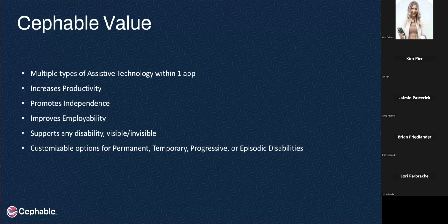We're looking to help everybody not just promote independence, but maximize the independence that they're capable of based on capabilities and strengths and not deficits. On a personal note, as a therapist justifying my services from a deficit lens for IEPs and insurance companies, it's been really exciting to talk with users and work with users and say, what can you do? What movements are easier for you? And then we can bring Cephable inputs to promote and maximize the independence they can have with their computers, with whatever their goals may be as they interact with their tech.